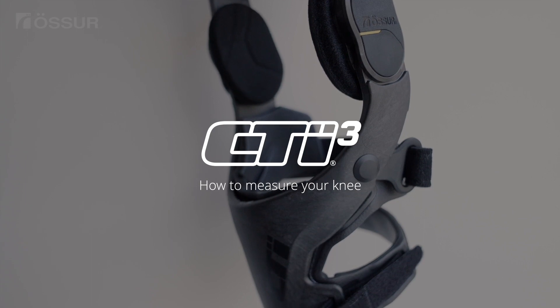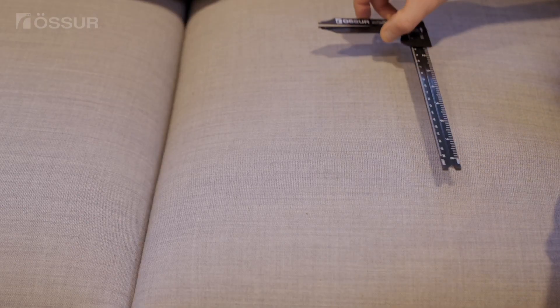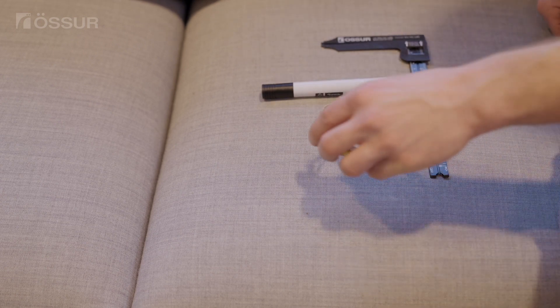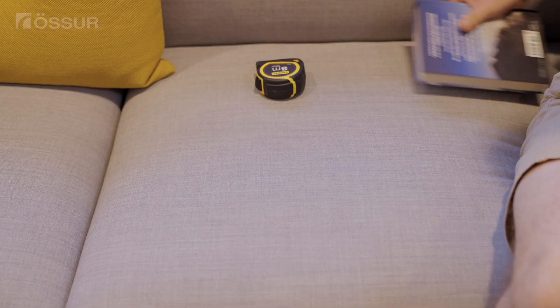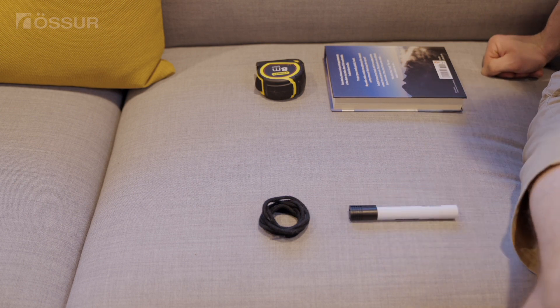To determine the correct size of your knee brace, we recommend you use the following items to measure your knee: calipers, a marker, and a soft measuring tape. If you don't have calipers, we recommend a book or similar stable surface. You can also use a string or shoelace and a ruler or measuring tape for circumference measurements.